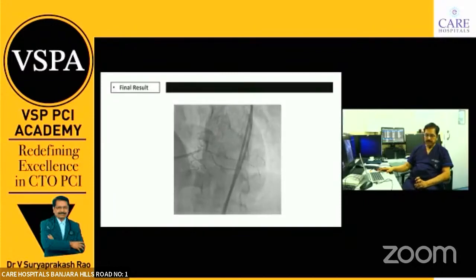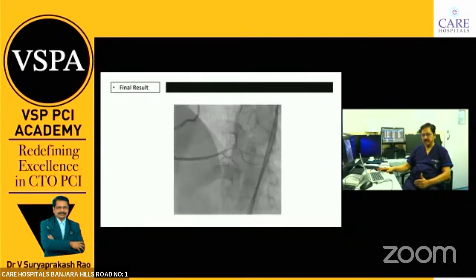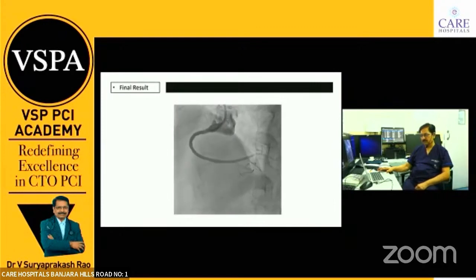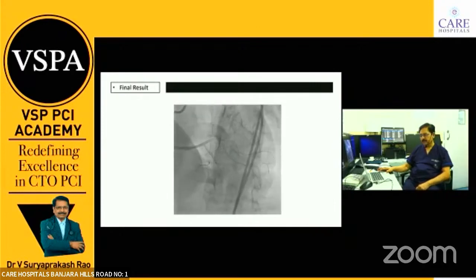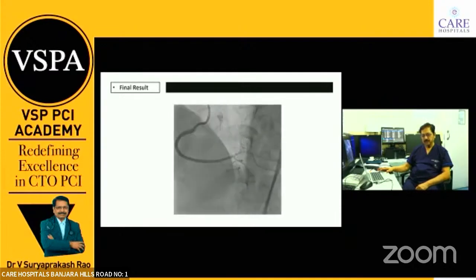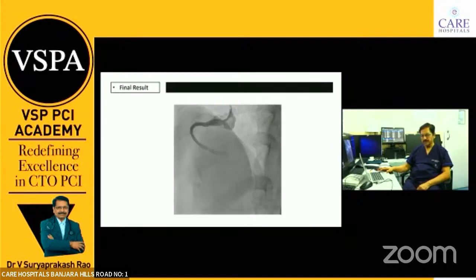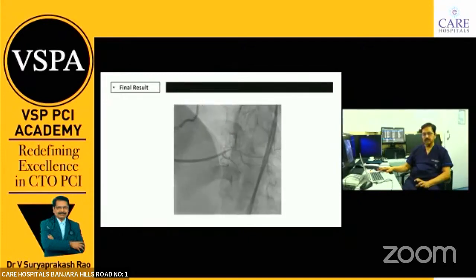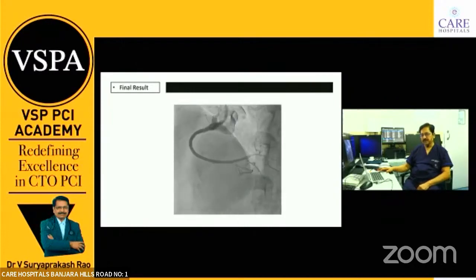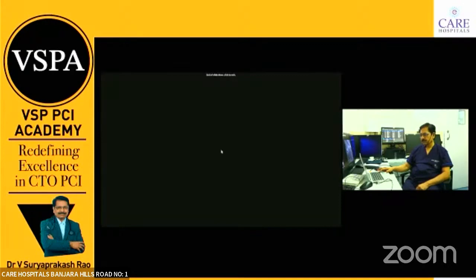Very important. Don't get disappointed by the distal vessels in these cases. Mostly in 6 months' time, all these vessels will grow, and sometimes it can be spasm. You check with the IVUS, you give some nitroglycerin, and these things will improve the vessel sizes. And see that there are no distal leaks. Small perforators can cause slow perforation even after 24 hours. That's also important.